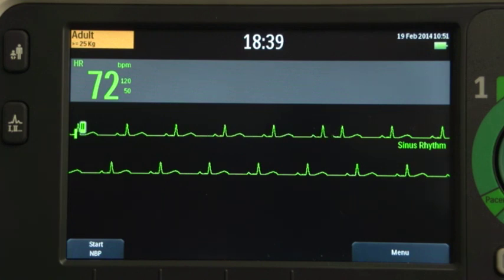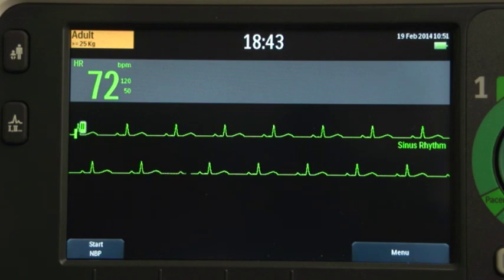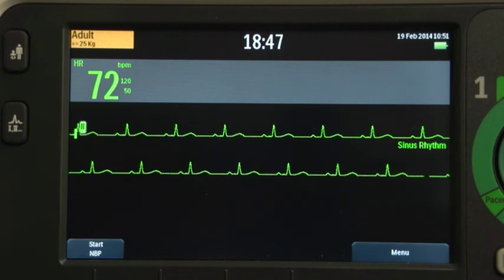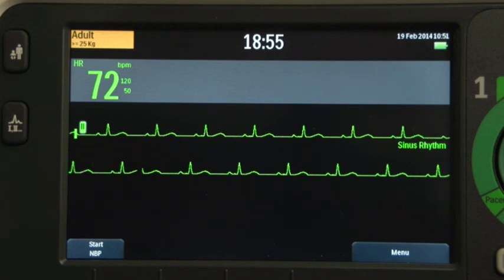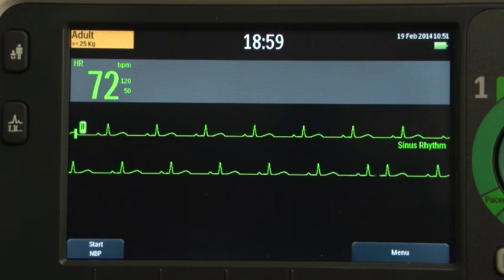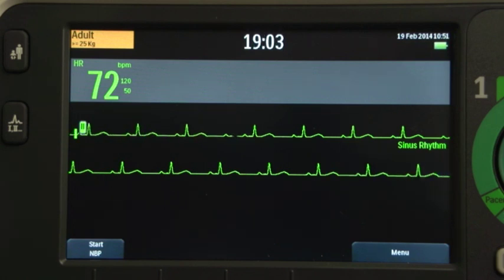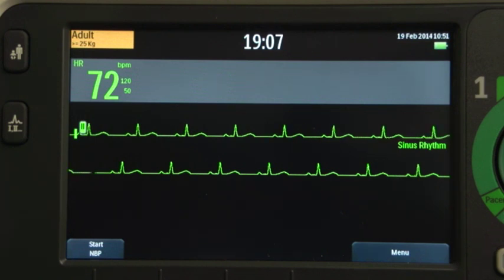When you turn on the DFM100 in monitor, manual defibrillation, or synchronized cardioversion mode, or switch into one of these modes from another mode, the default lead is displayed in WaveSector 1. If that lead is not available or has poor ECG quality, the device automatically searches for the ECG lead with the best quality and displays that new lead in WaveSector 1.